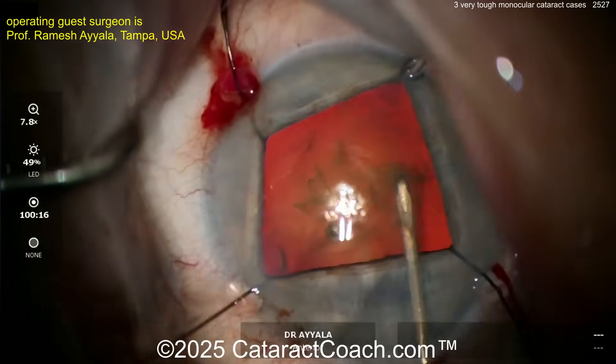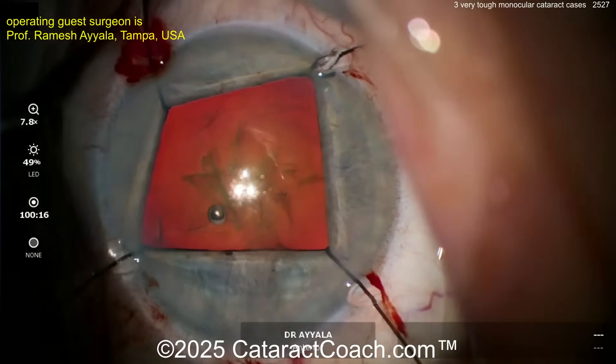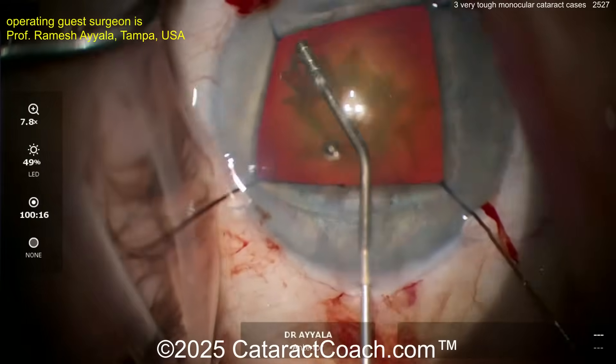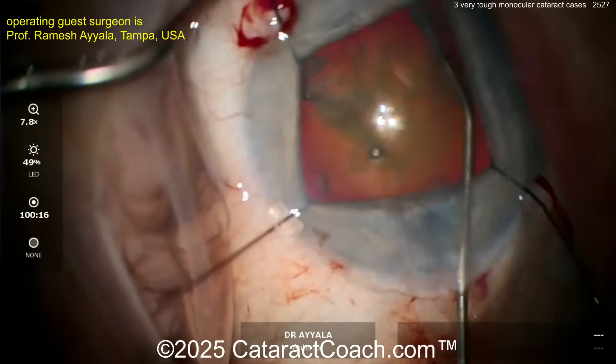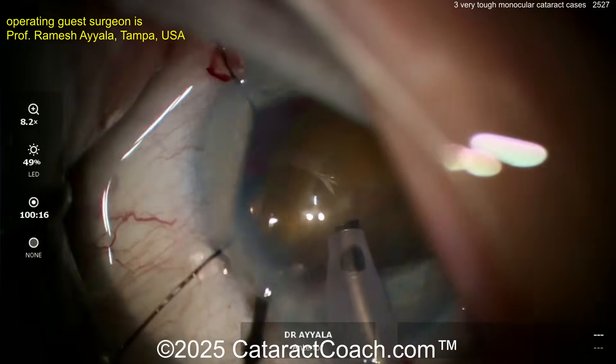Now back to our case. Getting the rhexis done — this is not easy. The AC is so shallow that sometimes it's really hard to get enough room to work in there. Now going in with some gentle hydrodissection; you've got to be very careful here. All the videos are sped up today to keep things efficient.